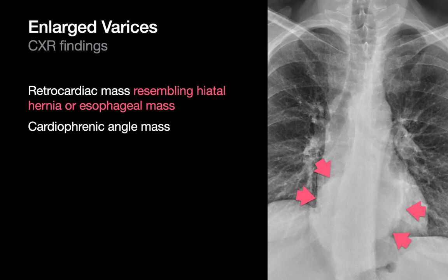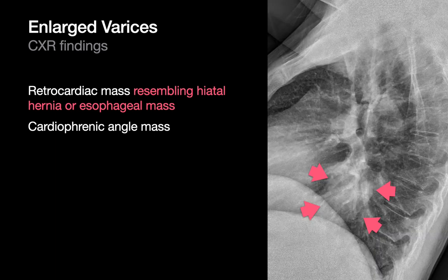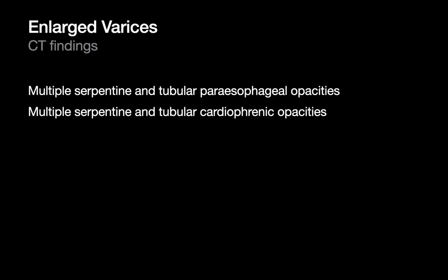Enlarged varices are another central venous disorder. When varices become very large, they can manifest as a retrocardiac mediastinal mass on chest x-ray that resembles a hiatal hernia on both frontal and lateral images. However, the diagnosis of enlarged varices on CT is relatively trivial, especially if you've given the patient intravenous contrast. Good places to look for varices are around the lower esophagus and near the cardiophrenic angles.